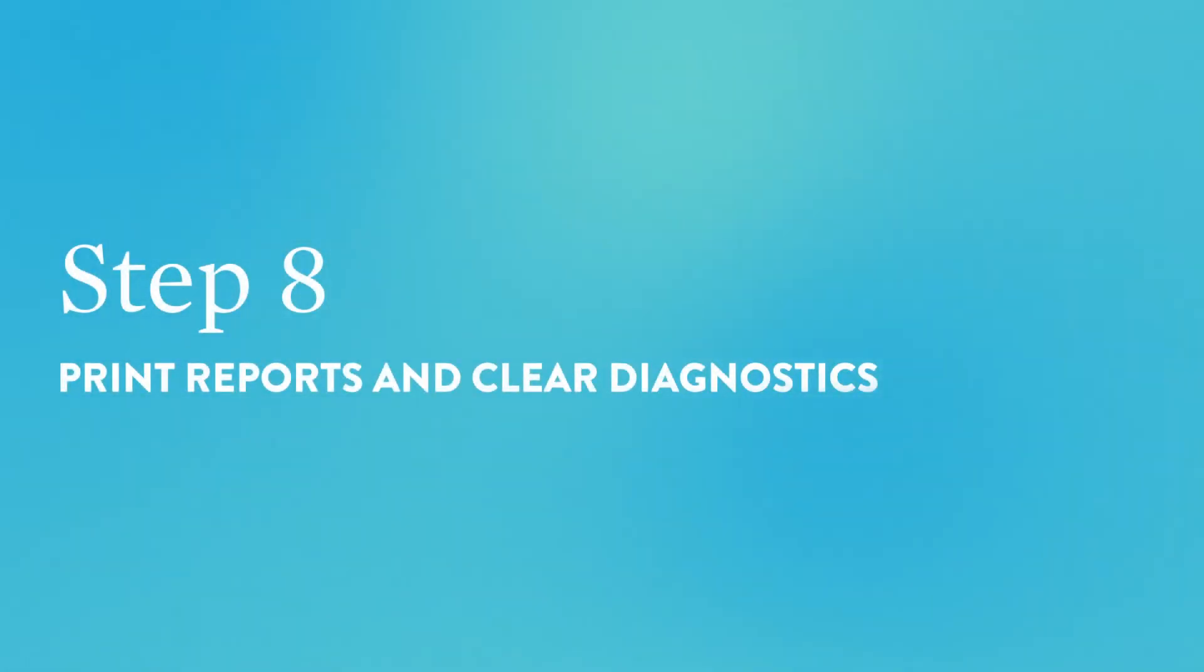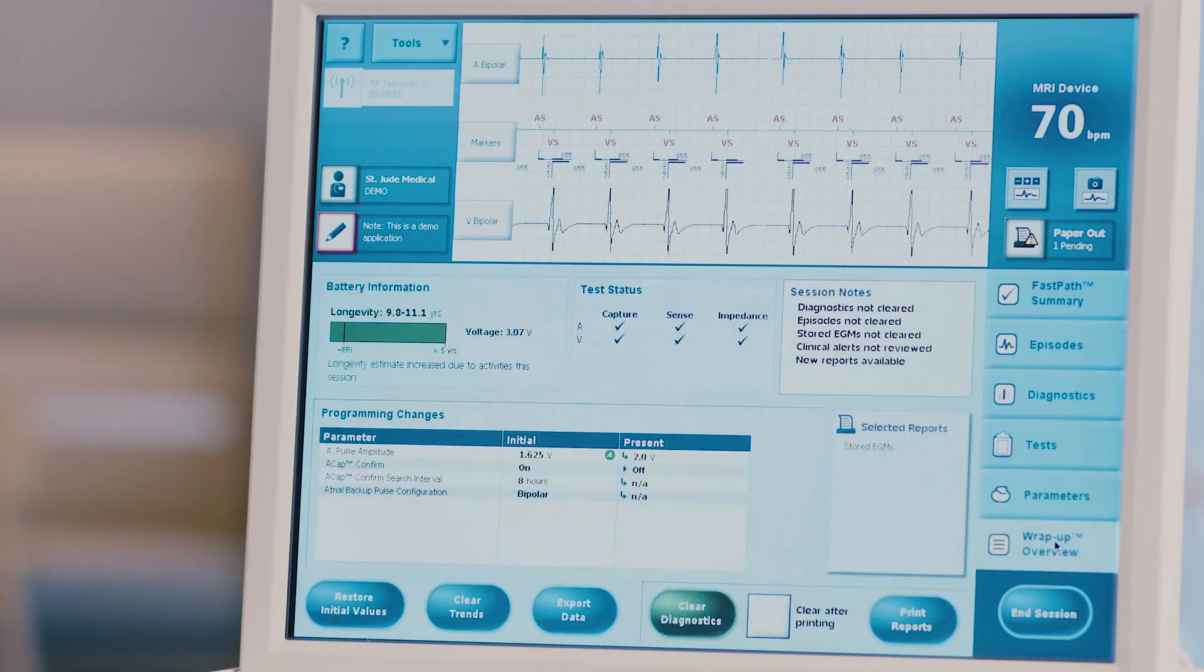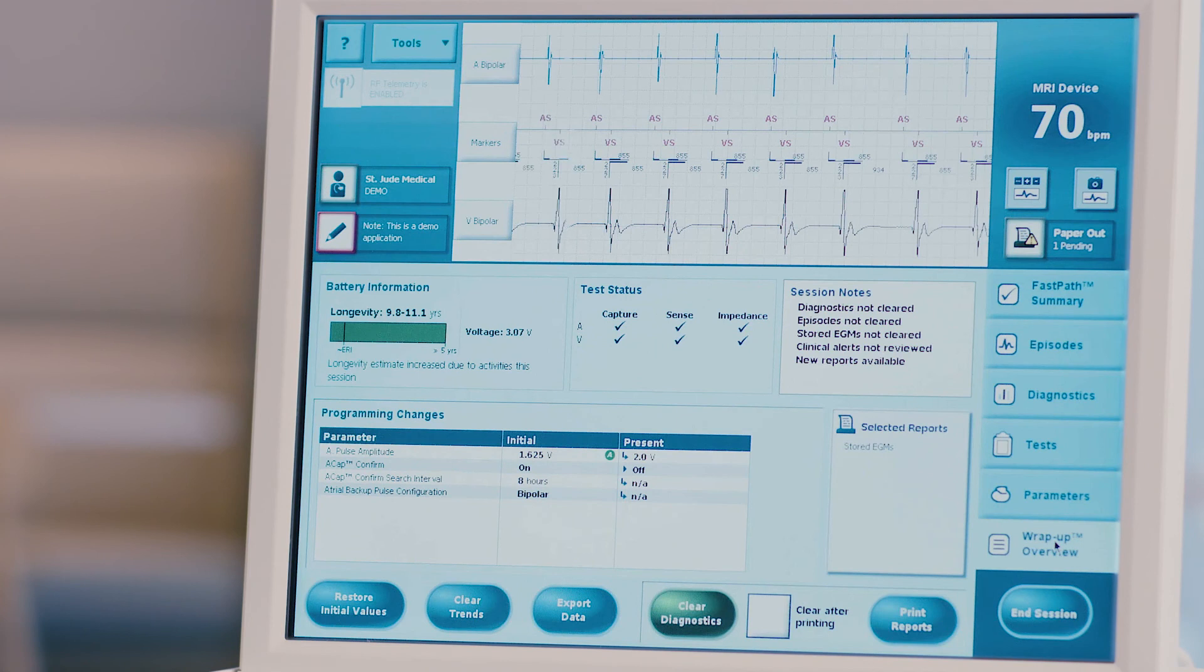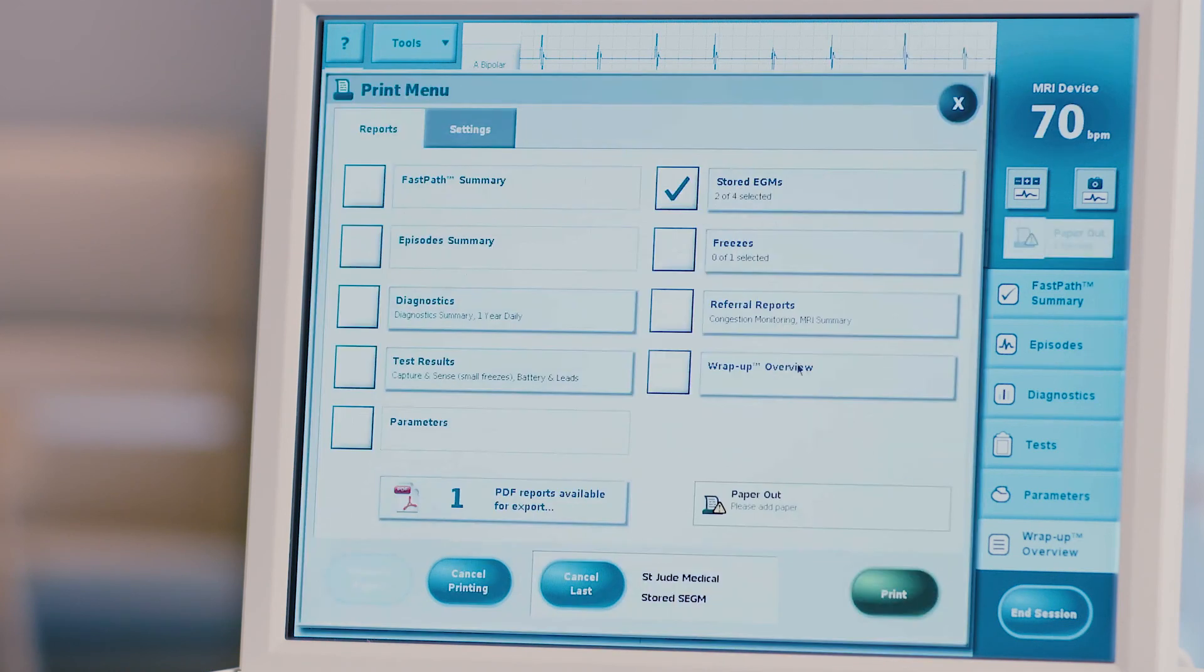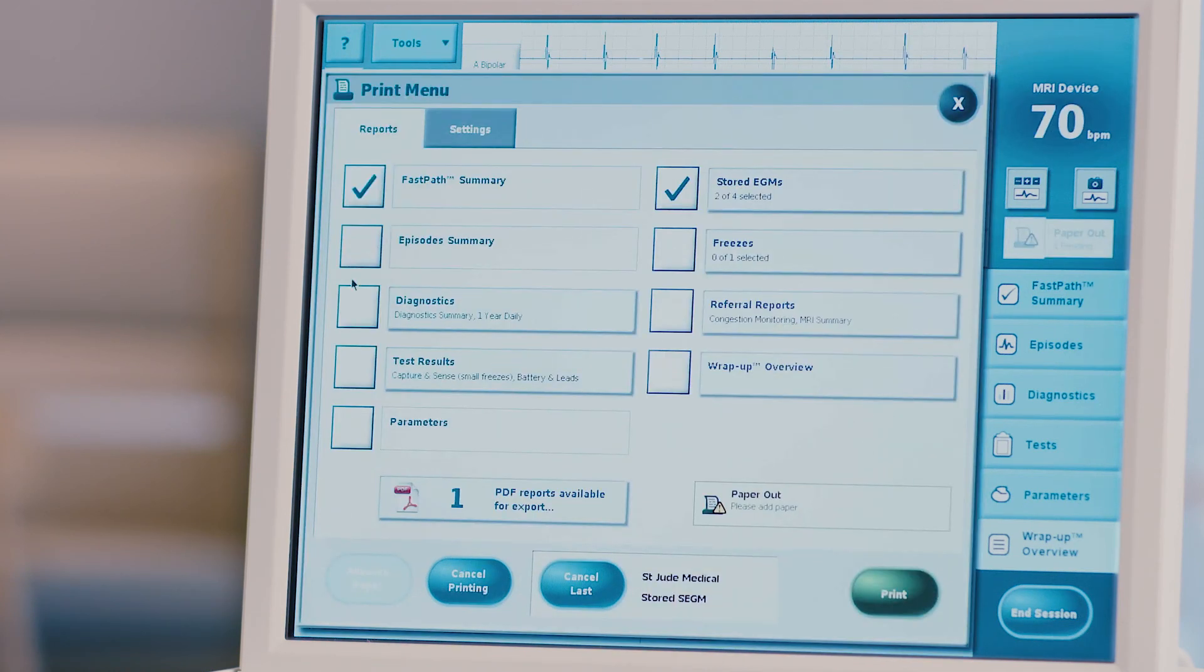Step 8: Print reports and clear diagnostics. Press the wrap-up overview tab on the right hand side of the screen. Note the box labeled programming changes made this session. If you did not intend to make any permanent programming changes, be sure this box is empty. Press selected reports to choose which reports you would like to print. Note that any episodes selected for printing earlier will be automatically selected here. Press the green print button to print reports.